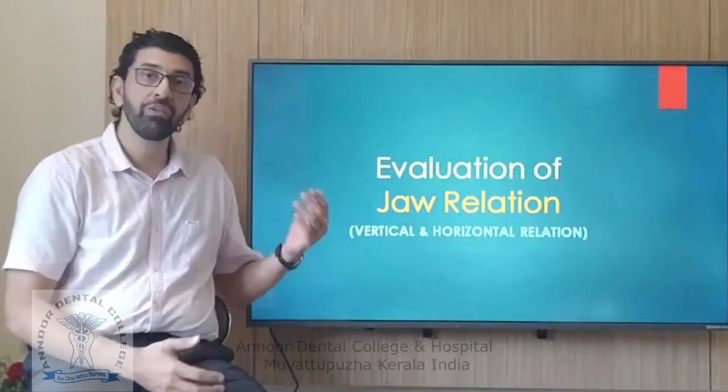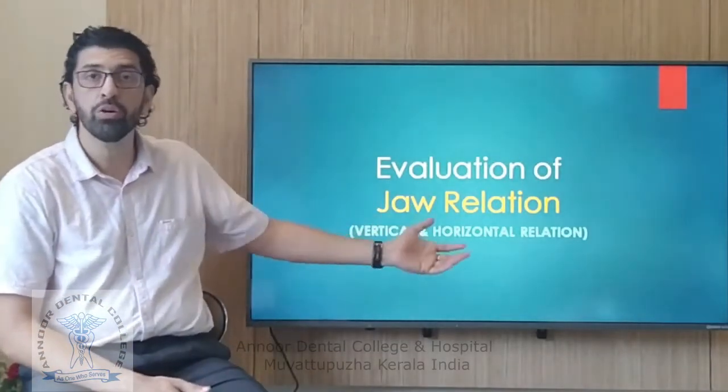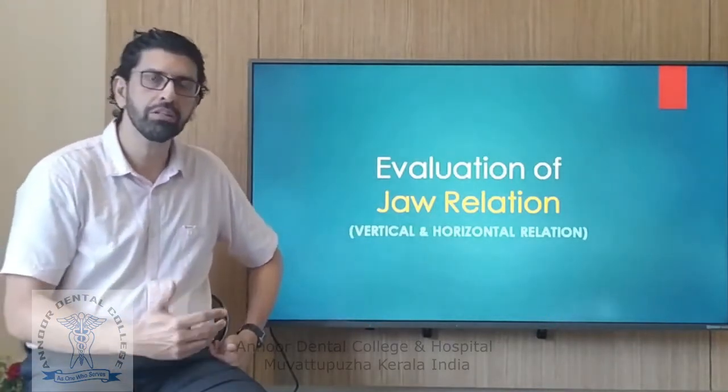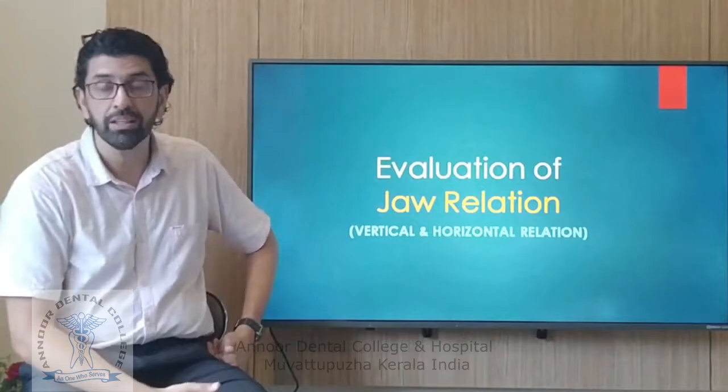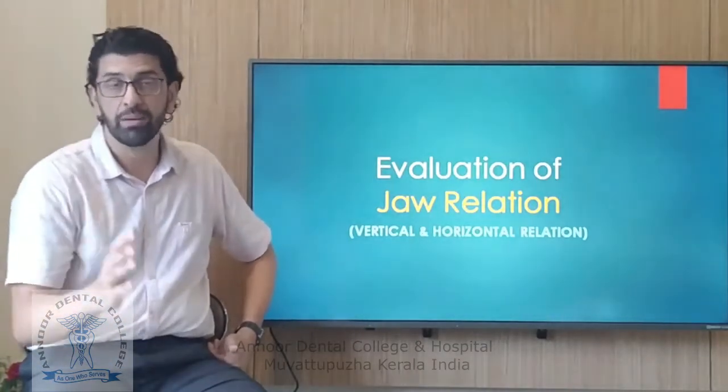So next we have the evaluation of jaw relation, and obviously here we're going to do the vertical and the horizontal relation. We're going to check those because the occlusal relation, we hope that you've done it right and you've checked it and made sure that it is perfect at the time you did it.